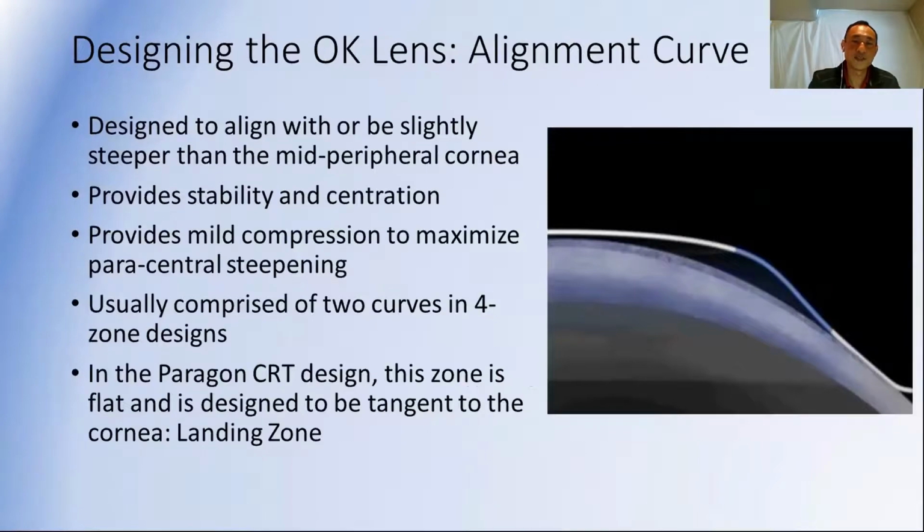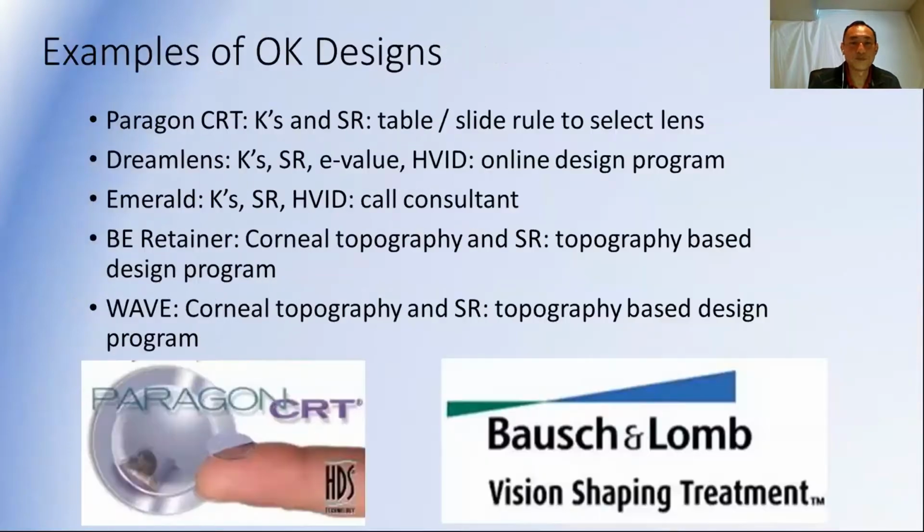And that's one of the ways we can tell if the patient is becoming more myopic. We have them put the lens on and check their vision. If their vision is still clear with no overrefraction, then we know that their eye has not become more myopic, the axial length hasn't increased. If they are taking minus over the lens, then they've probably increased the myopia.